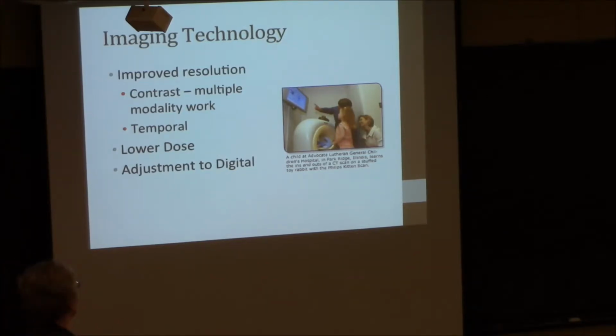And probably the biggest one has been in contrast resolution. I'll go through a real quick definition of it, and a lot of work with multiple modalities, doing the same thing with multiple modalities and trying to fuse them together in a way to give additional information.